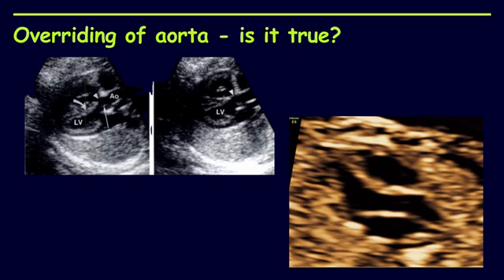Similarly, when we take the left ventricular outflow tract view, we can sometimes come across an echo dropout. To determine if it is a true or false finding, first look at the site of the echo dropout in relation to the aortic valve. If it is above the level of the aortic valve, it is unlikely to be a VSD. If it is below, there is a possibility it could be a perimembranous outflow VSD. In such cases, apply color Doppler to look for bidirectional flow. If doubt remains, acquire a five-chamber view. Seeing the LVOT view similar to the third picture will help exclude pseudo echo dropouts with confidence.